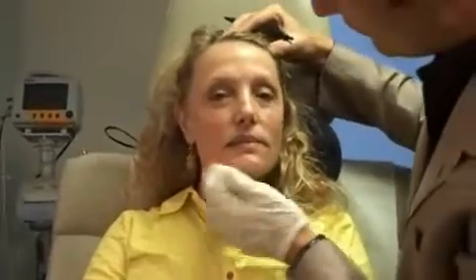She's still alive, and she responded great. She's a little red. She has no makeup on at this point. She'll have probably no more swelling than she does have now. So both these substances aren't very reactive.